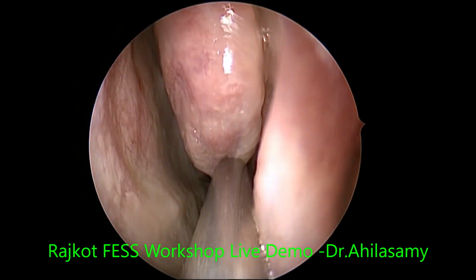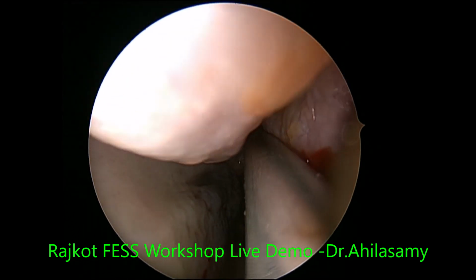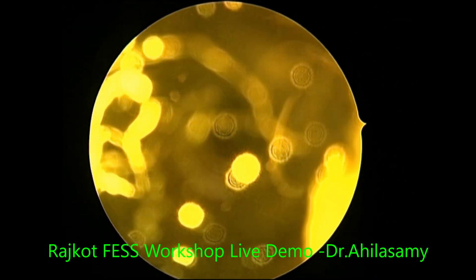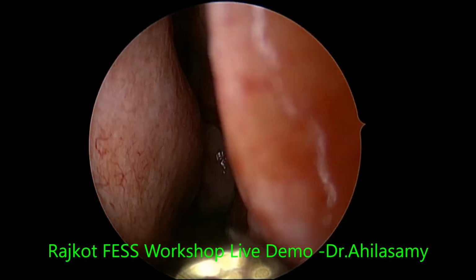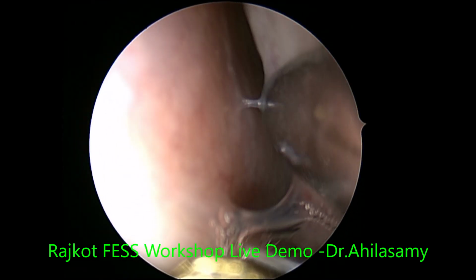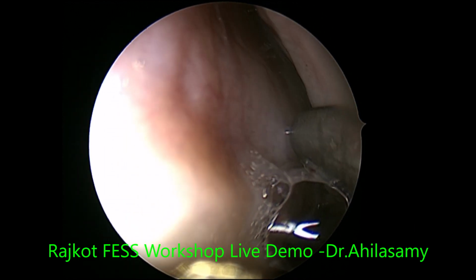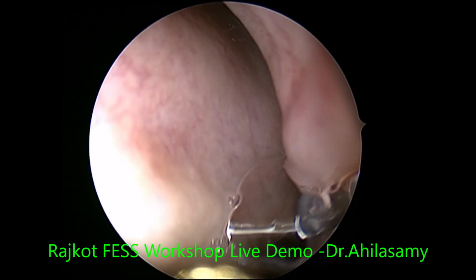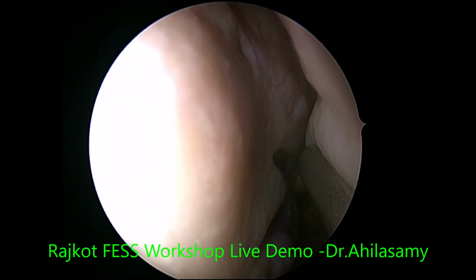I am not a very big favorite of the douche, but I use intranasal itraconazole. Madam wants to see the other sphenoid. I said it's normal, only mucosal thickening. There is hardly any discharge, only the mucus. In the CT there is only mucosal thickening, and in the MRI it was clearly seen it's only on the right side. So there is nothing.